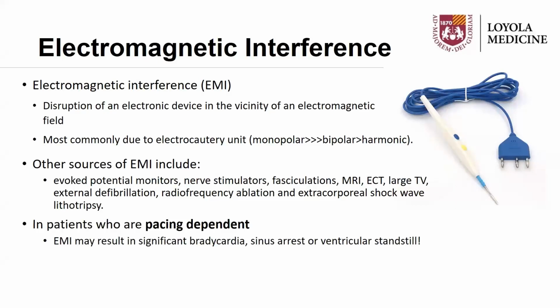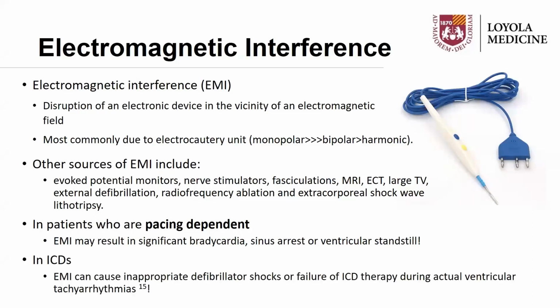In patients who are pacer dependent, EMI may be misinterpreted as intrinsic cardiac signals, resulting in oversensing and inhibition of pacing, causing significant bradycardia, sinus arrest, or even ventricular standstill. In ICDs, EMI can cause noise, which provokes inappropriate defibrillatory shocks. EMI may also potentially result in the failure of ICD therapy to detect actual ventricular tachyarrhythmias.